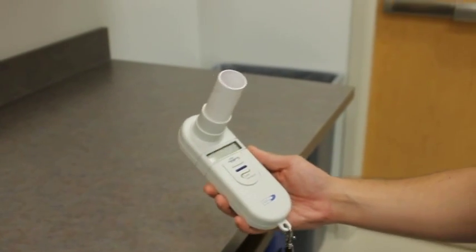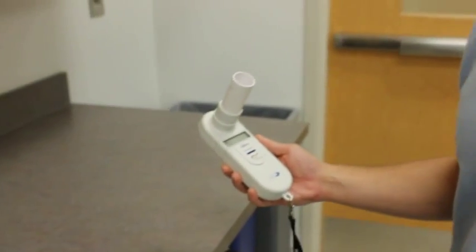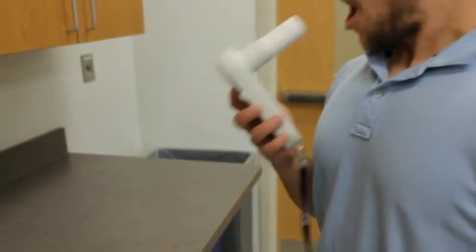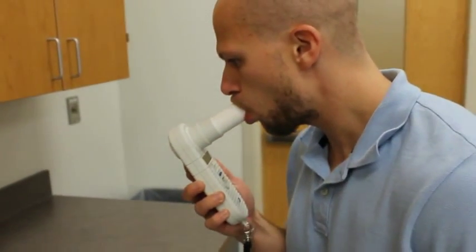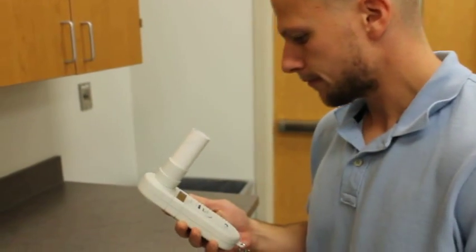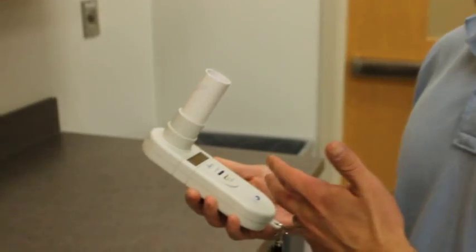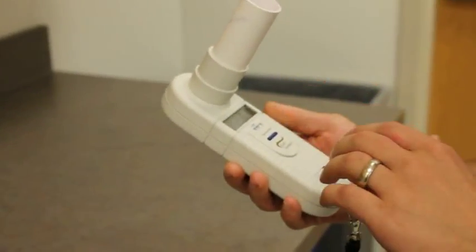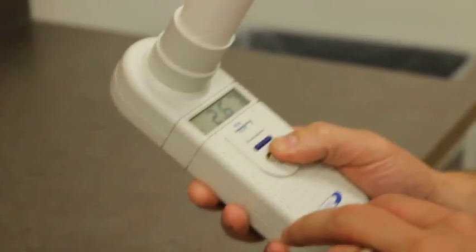So you take your max inhalation to the side, and then you do a max expiration into the mouthpiece, and then it will give you your values.